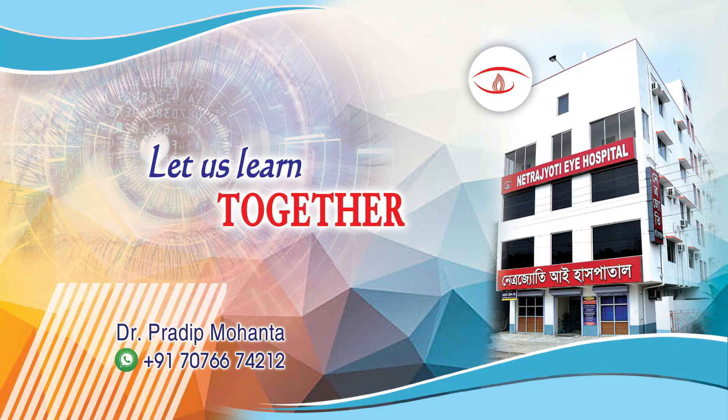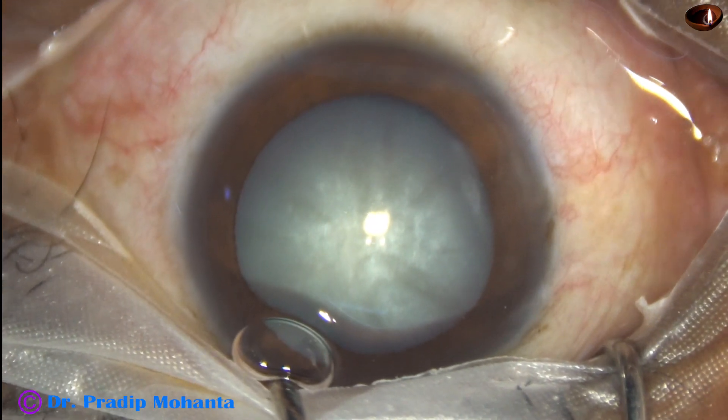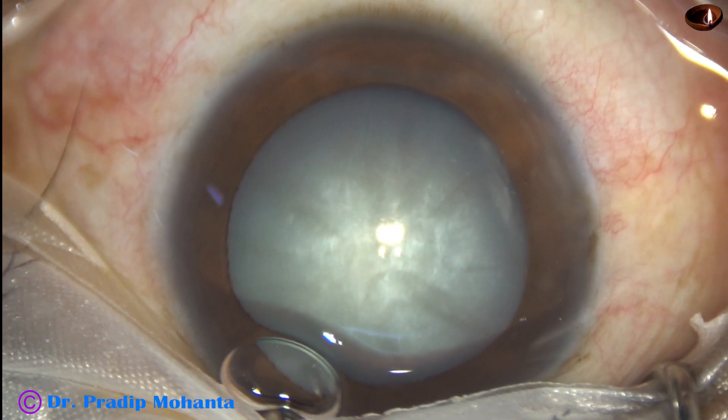Young colleagues, welcome to my workplace for hands-on FACO and SICS training. This is an intumescent cataract. Let us see how I managed this case. I am going to discuss what I did and what you should not do.